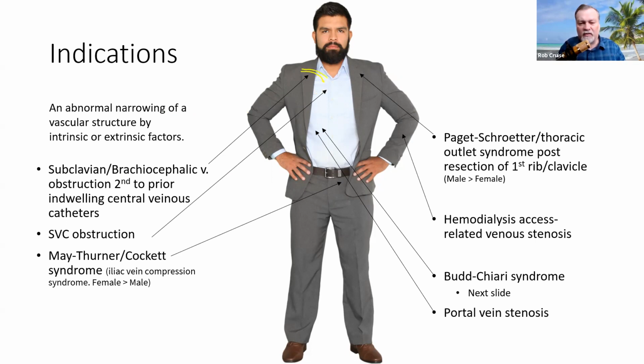So you have the vessels come in and there's maybe some scarring or some growth here in the center, and you will go in and do an angioplasty and return that to its normal caliber. Okay. Also at the top, we have the thoracic outlet syndrome.